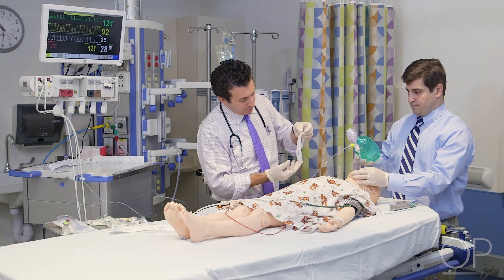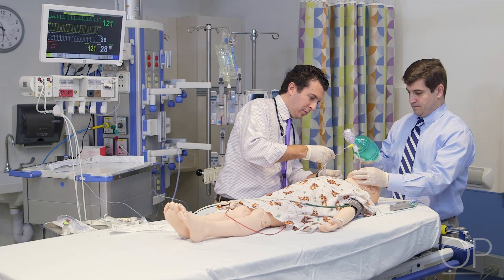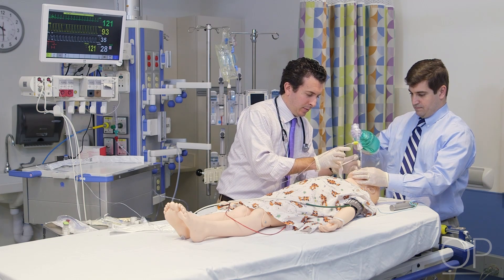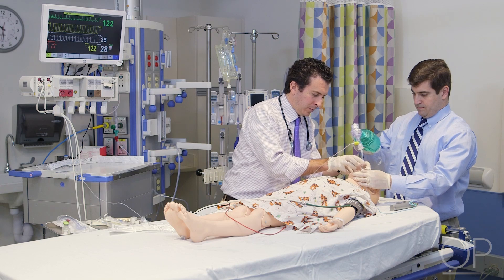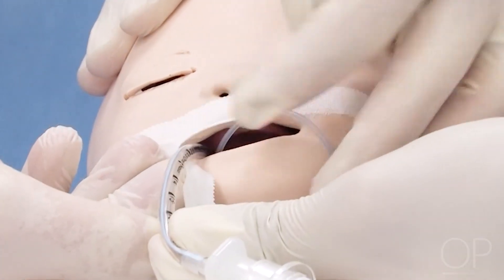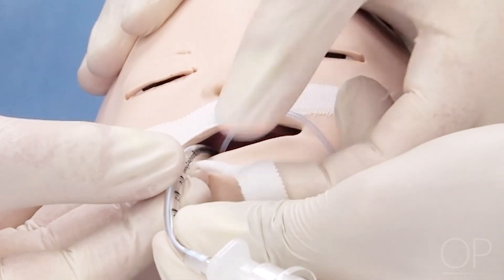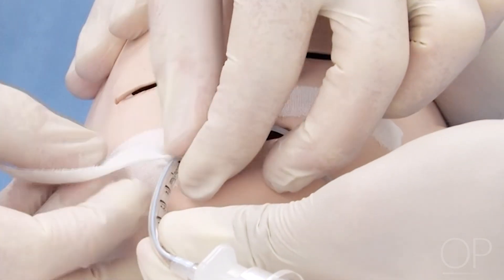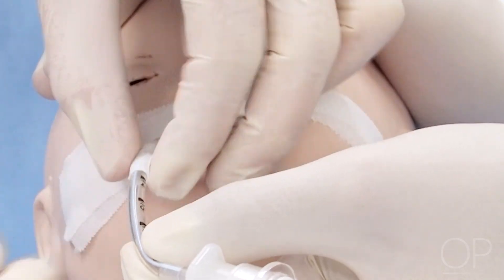Once proper endotracheal tube position has been confirmed, the endotracheal tube should be secured using a commercial endotracheal tube securing device or tape according to local practice. While the endotracheal tube is being secured, the provider who performed the intubation should continue to hold the endotracheal tube in place using their thumb and index finger.